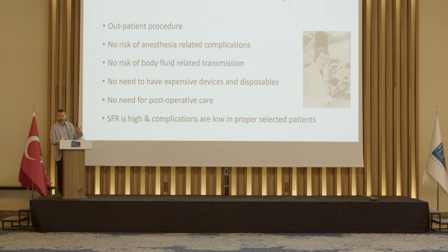But in the end, now it's over 40 years old. It's losing a lot of ground. It's not so popular. But in the end, it definitely still has a good role in our daily practice, especially in the developing countries.